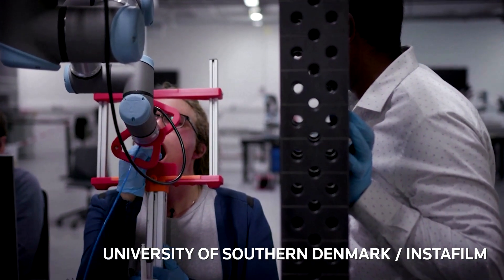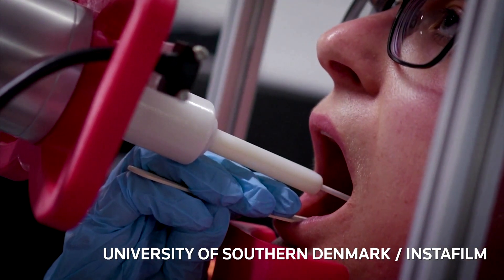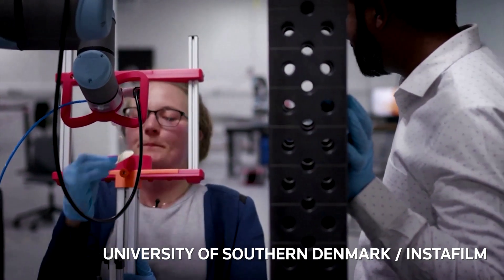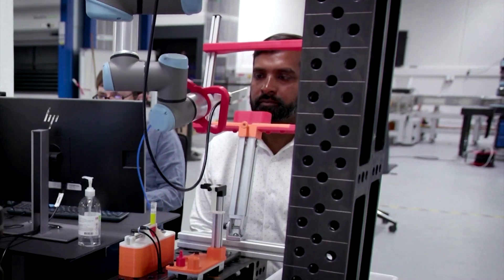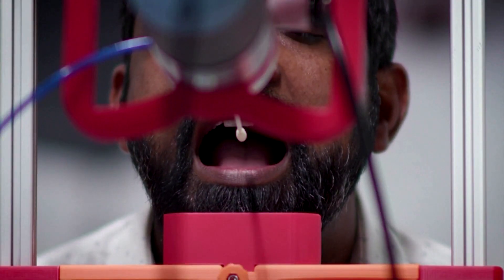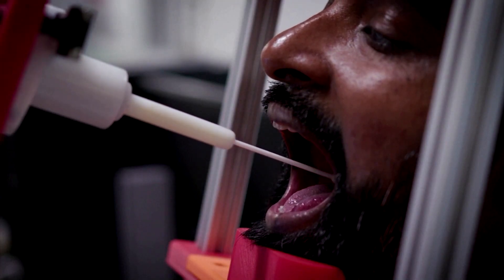Danish researchers say they've built a robot that can keep healthcare workers safe from infection whilst taking swabs. The so-called swab robot is a prototype built by a team at the University of Southern Denmark and Lifeline Robotics, and they hope it can be released soon.